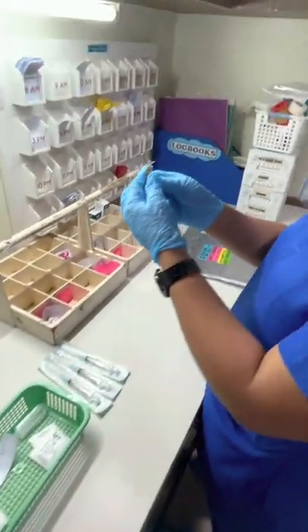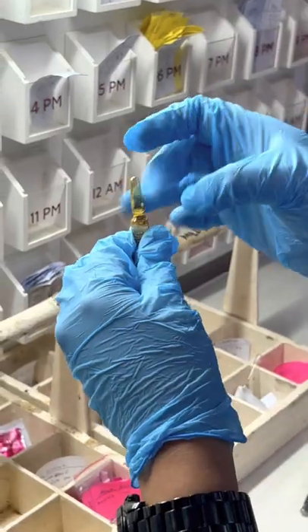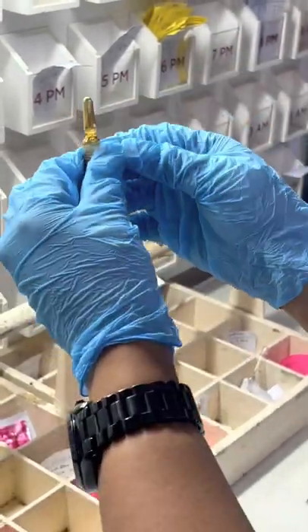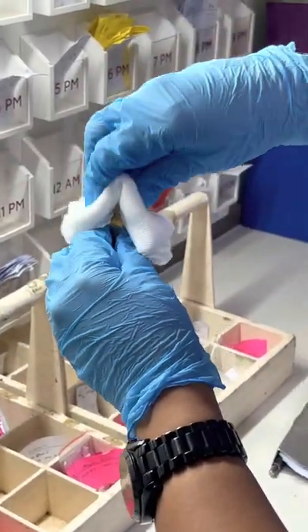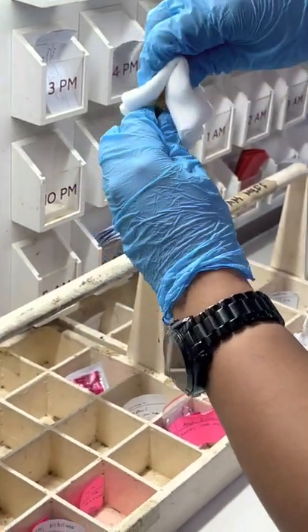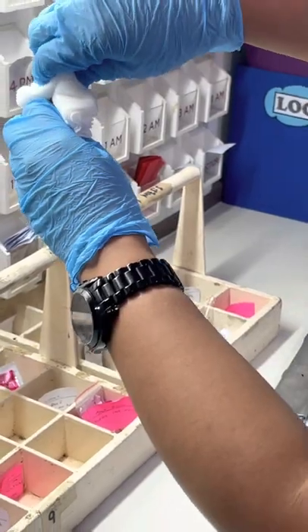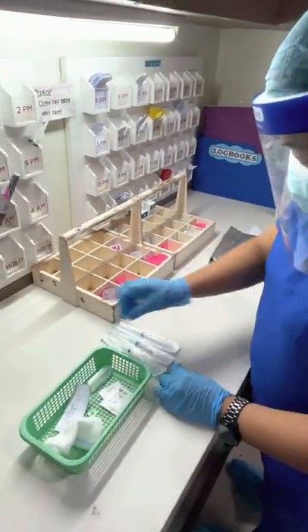You have to make sure that you break the ampoule carefully. As you can see, there is a white dot on the ampoule. Make sure that it should be facing away from you when breaking it. You may use gauze or a handkerchief if you don't have any gauze with you. Just make sure that the white dot is facing away from you when you break it.